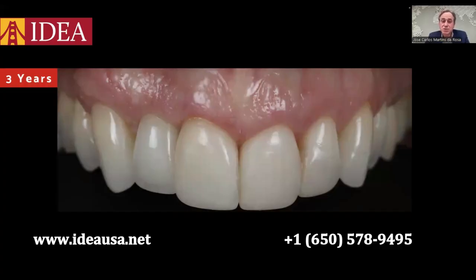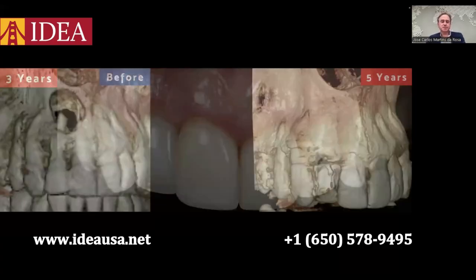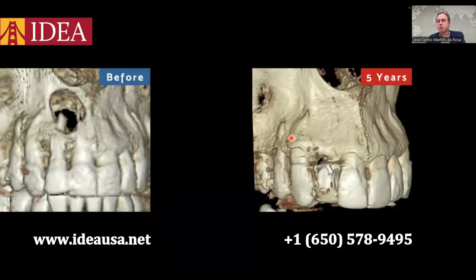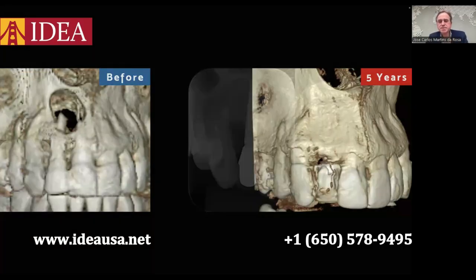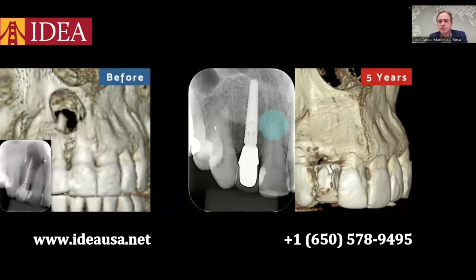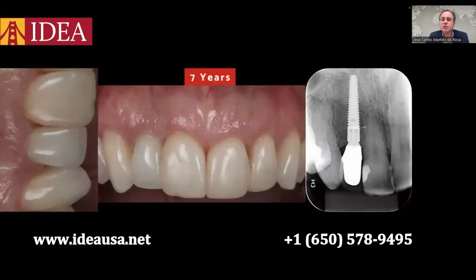The gingival architecture is being maintained, and this is the 3D image before and after 5 years. You see here that the bone completely remodeled and is still stable around this area, the new bone. And the X-ray: the tooth is still vital, number 8. The bone repair is absolutely fantastic at the apex of number 8, and we have the bone stability around the implant in number 7. So this is the clinical and X-ray follow-up after 7 years.